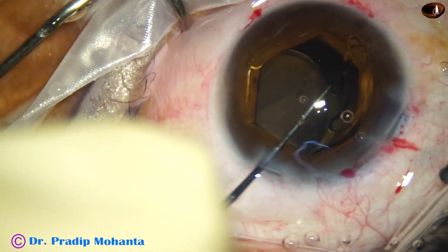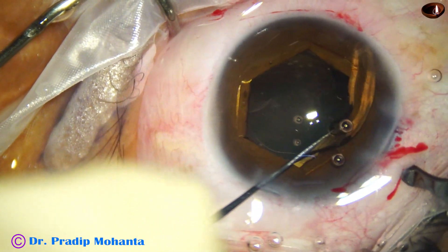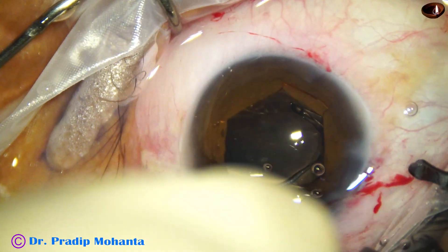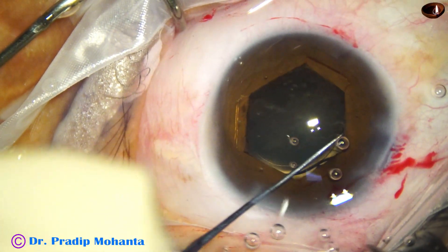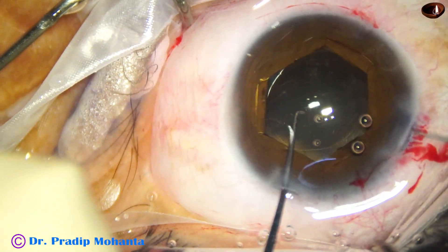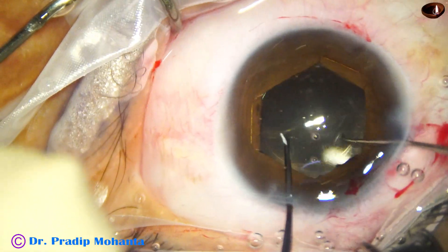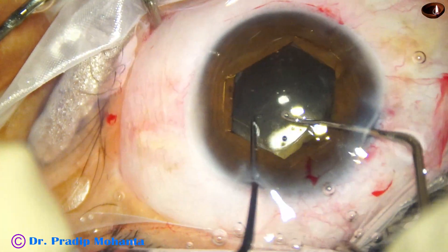One haptic — the trailing haptic — has not gone in the bag, and you have to be very careful. Should not place the B-hex yet. And very carefully it is placed in the bag by the left hand using the usual chopper.